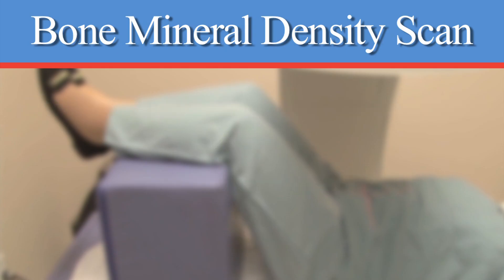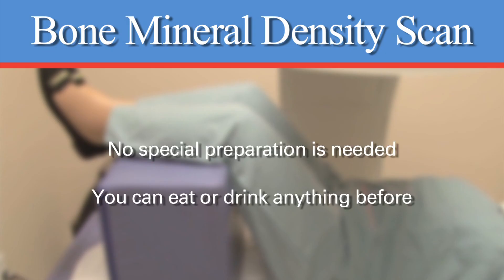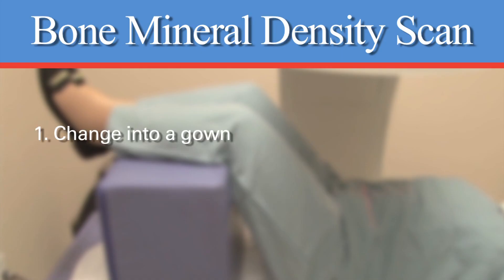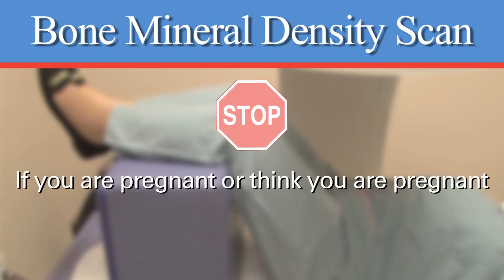Bone mineral density tests are easy and painless. No special preparation will be required. You can eat or drink whatever you like before the test. You will change into a gown and remove any clothing that contains metal buttons, metal buckles, or zippers. Please tell your health care provider if you are pregnant or think you are pregnant, as a DEXA scan could expose the developing fetus to radiation, which should be avoided.